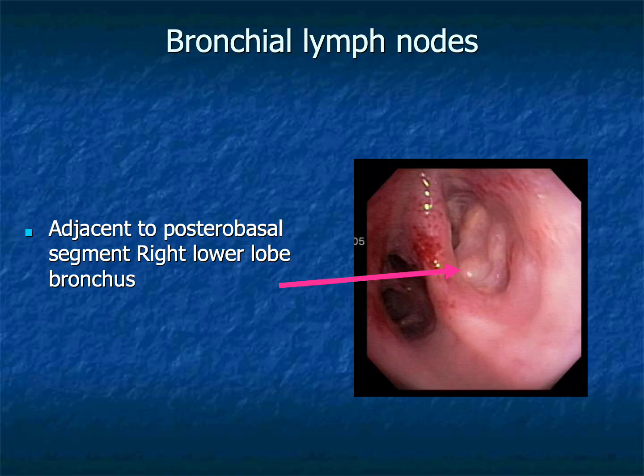Occasionally, lymph nodes adjacent to the airway become visible bronchoscopically. These may produce focal bulging, distortion of airway anatomy, or external compression. Recognition of their relationship to surrounding bronchial structures helps guide diagnostic sampling and interpretation of imaging studies.